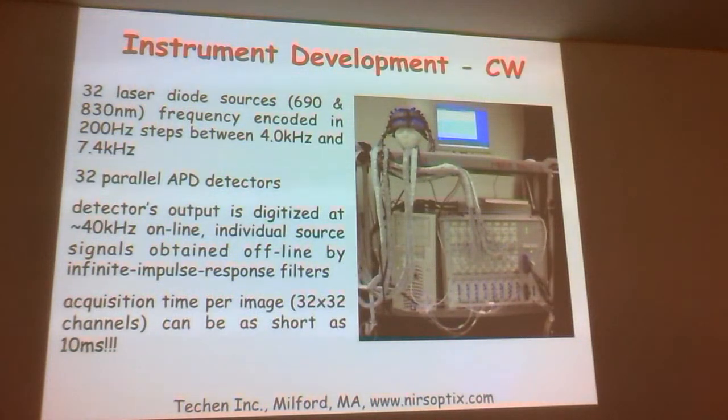It raises the shot noise floor, but we'd be so lucky if our measurements were limited by the photon shot noise. We're actually more limited by physiology in the tissue.